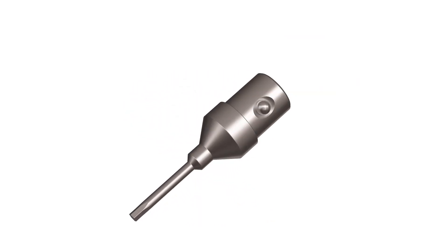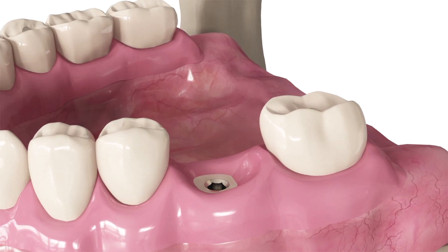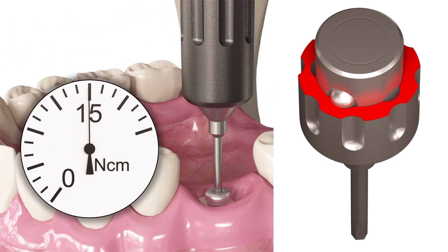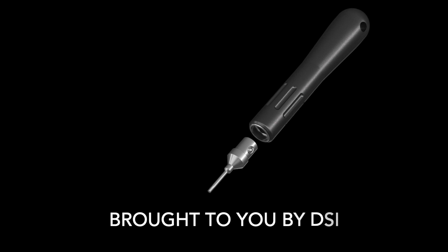The short driver is perfect for the anterior region, while the long handle adds extra reach for the distal areas. Confident and more comfortable than ever — Torque Limit Manual Drivers, brought to you by DSi.